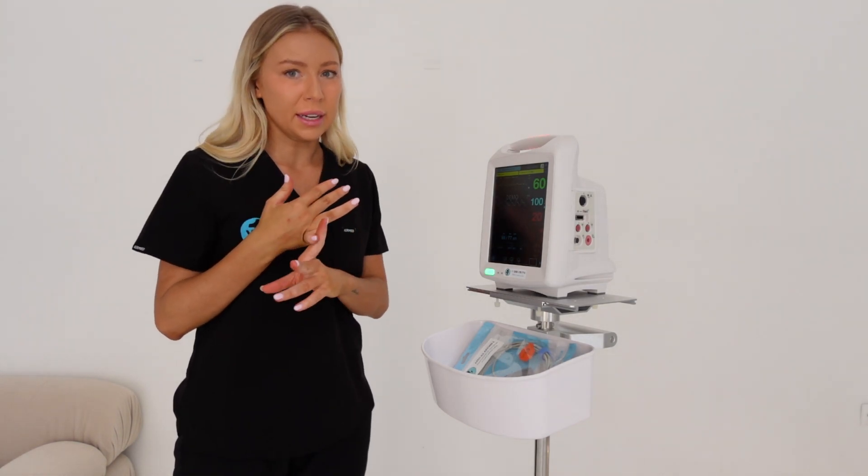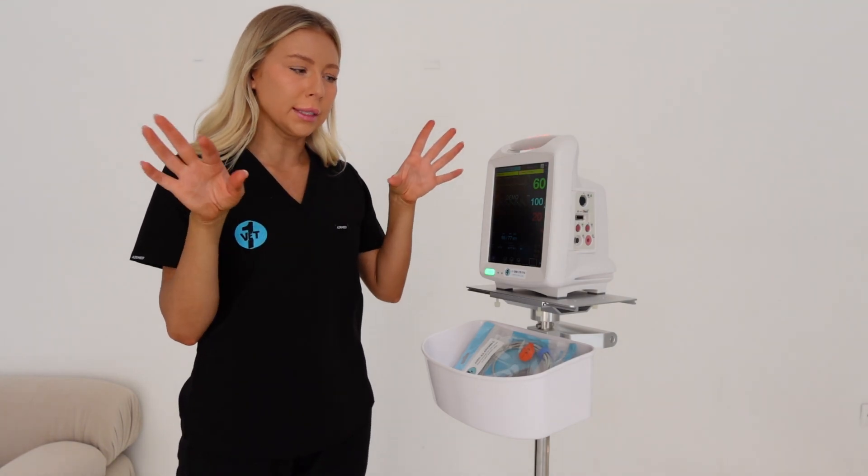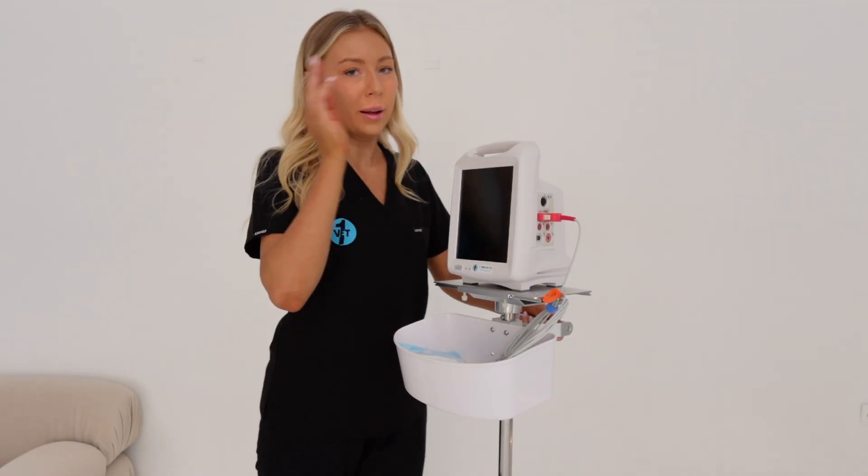A couple of things all these machines come with: they all have SunTech technology, which is the colourful blood pressure cuffs in different colours. They also have Masimo technology, which is your SpO2, which is pretty common.